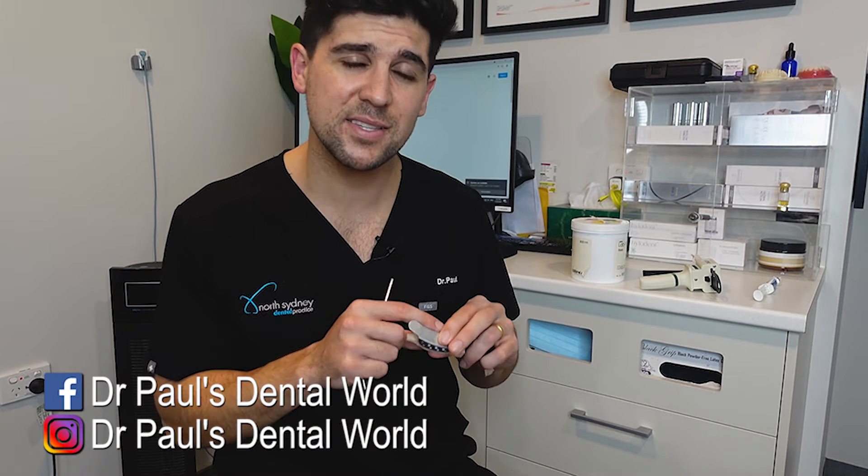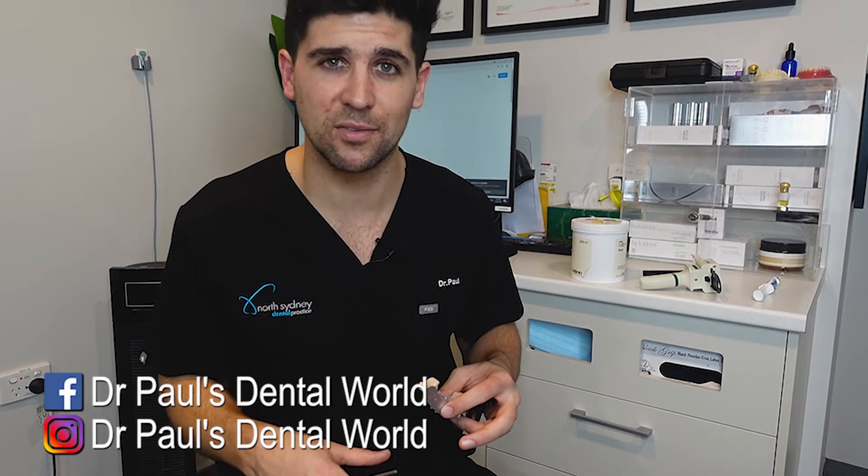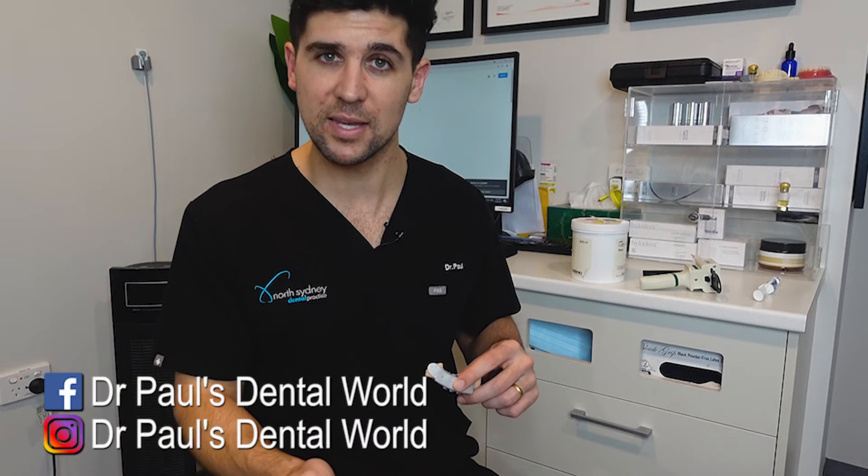Don't leave this too long onto the tooth. If you leave it for too long, when this sets, it actually shrinks and contracts slightly and it will stick and glue itself to the tooth. You don't want that. When you pull it off, you want to make sure the temporary crown comes off with the index.